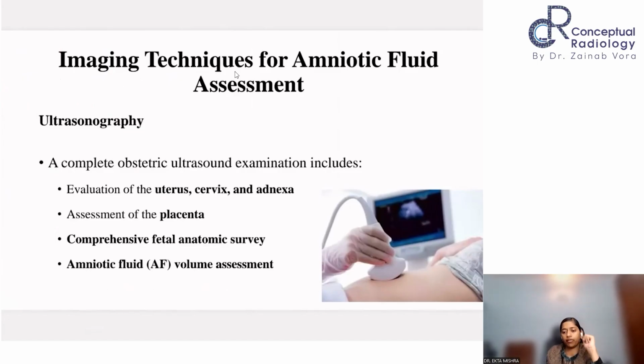image the amniotic fluid. First and foremost, what we all are doing is ultrasound. A complete obstetric ultrasound examination includes evaluation of the uterus, cervix, cervical length, internal os, and the adnexa. Then assess the placenta. So these are the basics. They need to be done in every case, irrespective of gestation.